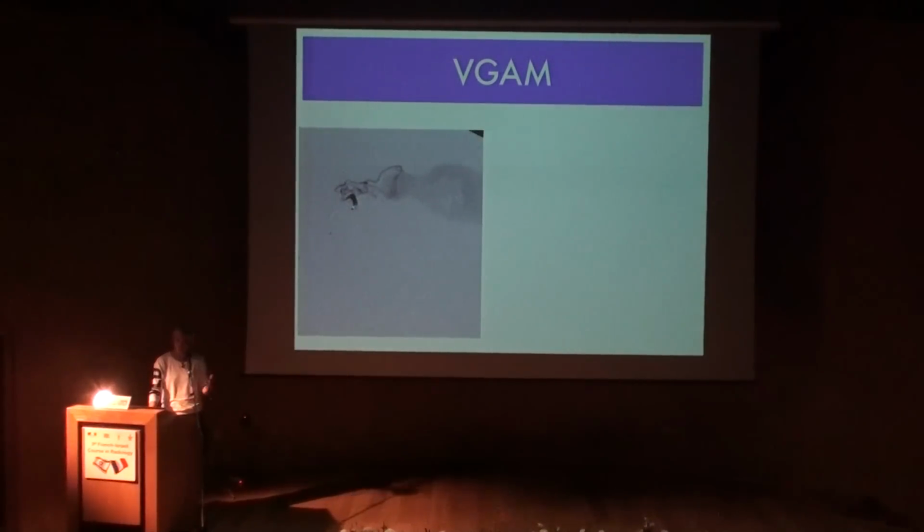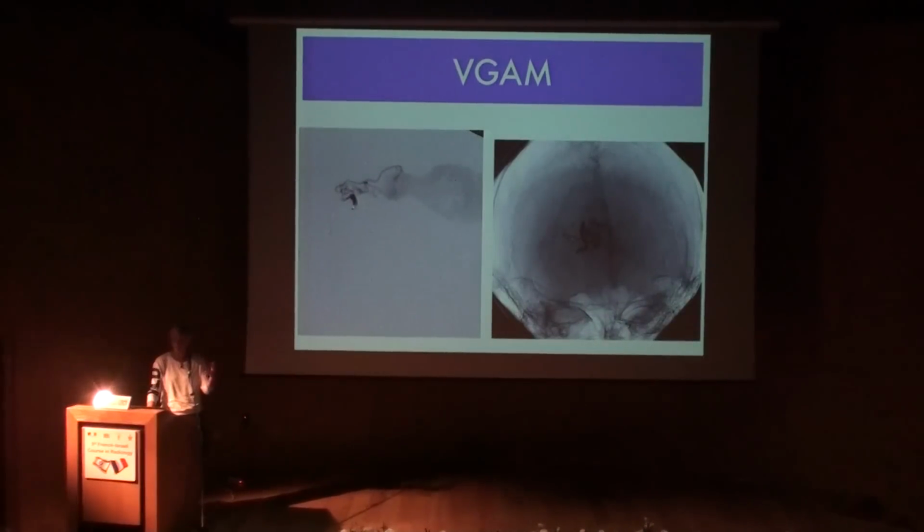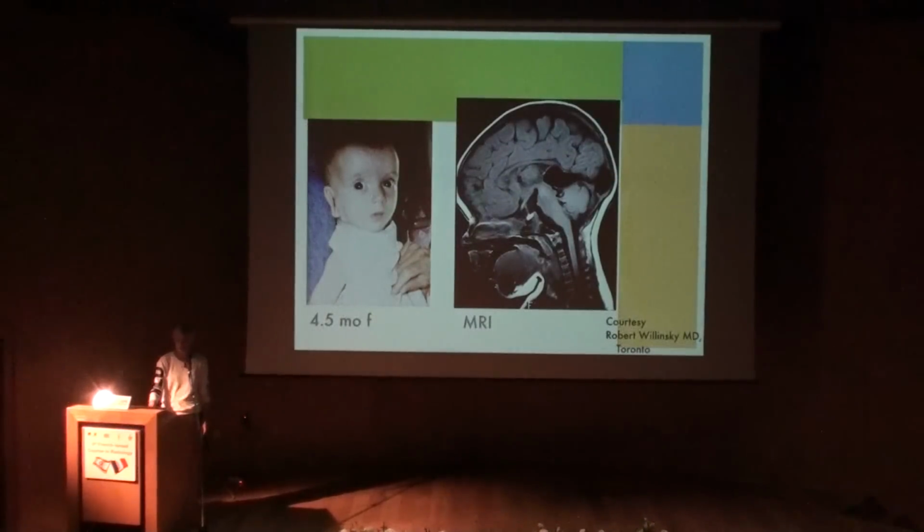This is just to show you the craziness of the treatment, and they have special centers to do it. You get the catheter, and you just try to occlude another vessel and another vessel and another vessel, and the kids end up with those images.